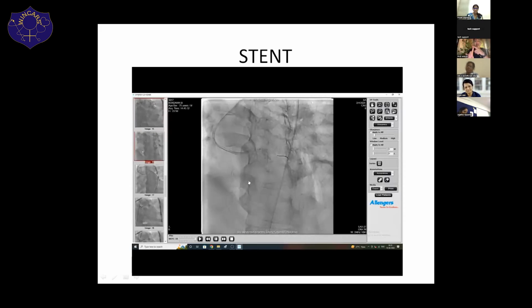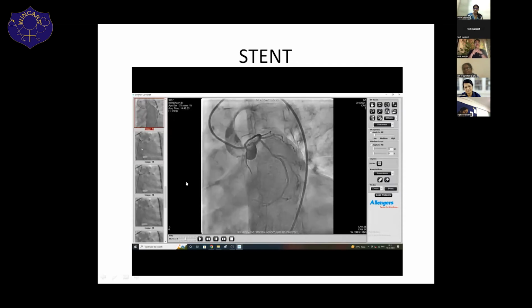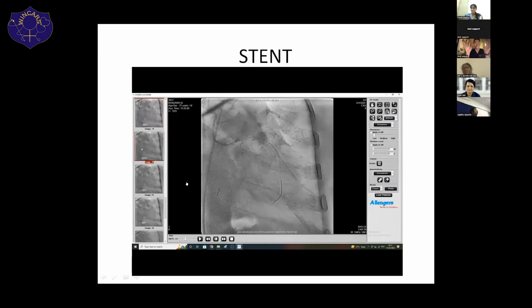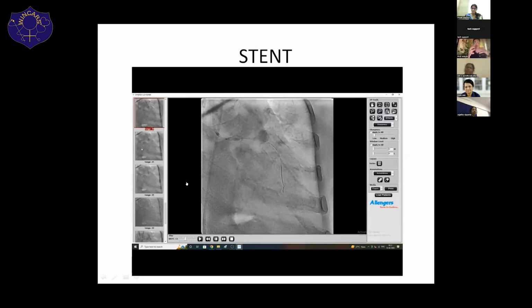So if you are having a calcified artery, and imaging showing you eccentric calcium as was there in this case, you can rest assured it is likely an eruptive nodule, and these eruptive nodules are usually very easily modifiable, even with a non-compliant balloon or the cutting balloon. That is why after your cutting balloon they were easily modifiable. Number one. Number two, the only problem with eruptive nodules is that they come back even inside the stent, but that's not a problem. But here the most important thing was that imaging showed that it was a calcified lesion.